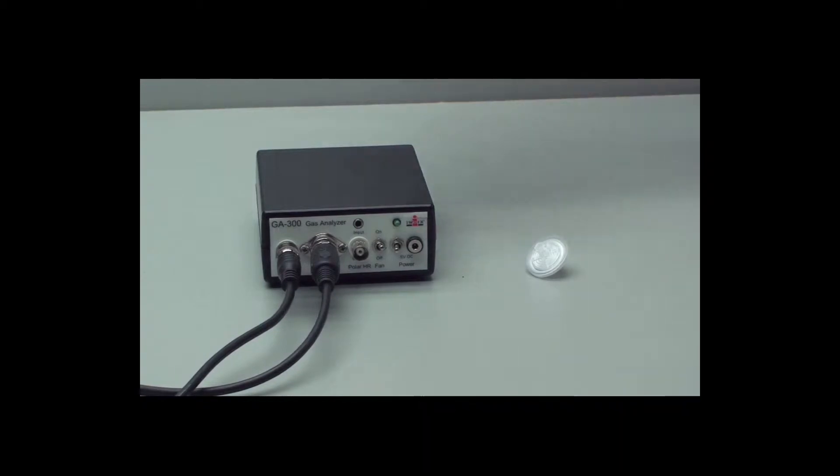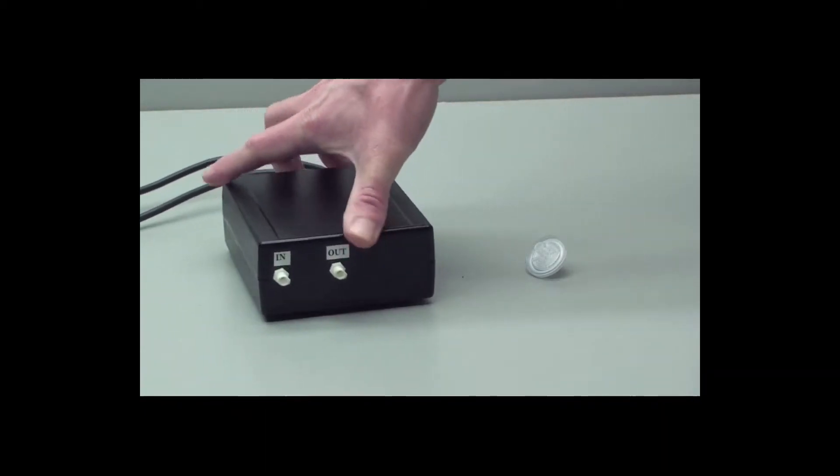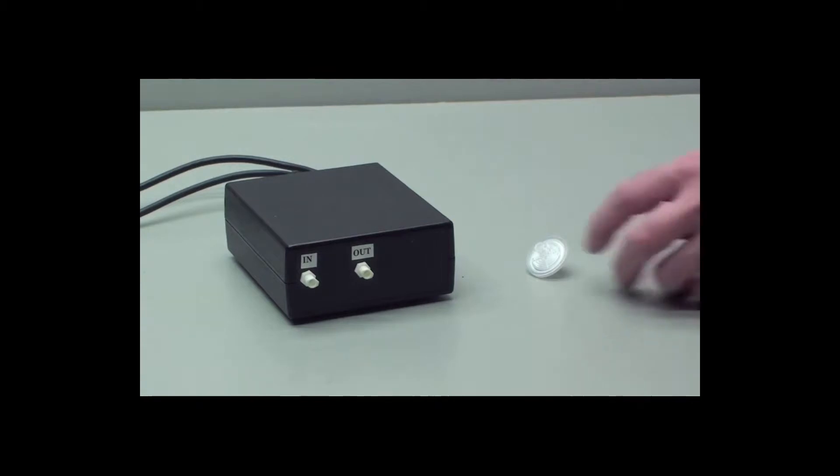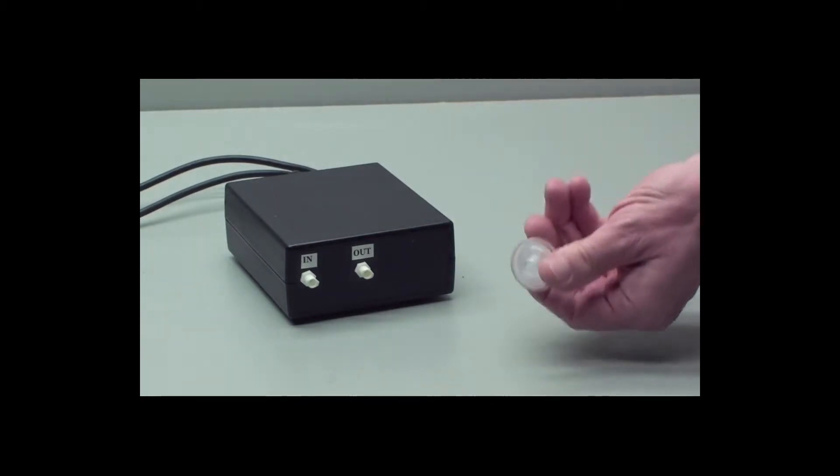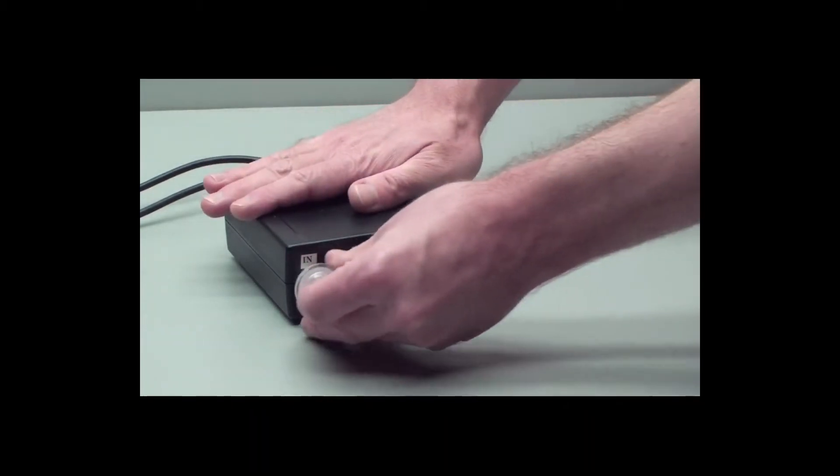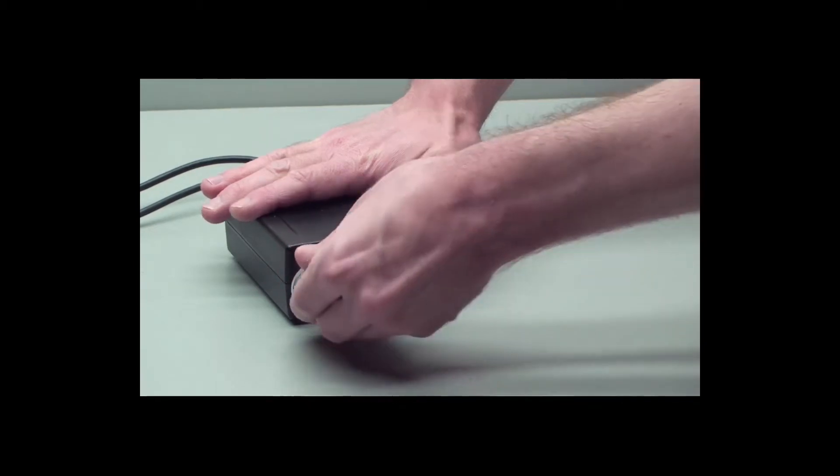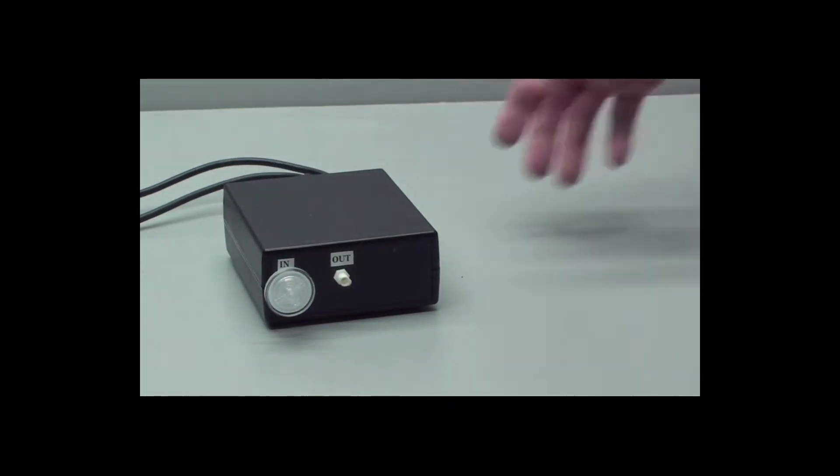Go to the back side of the gas analyzer, and for the filter, take the lure end, and that goes into the inlet of the gas analyzer. Don't over tighten, snugly is fine.